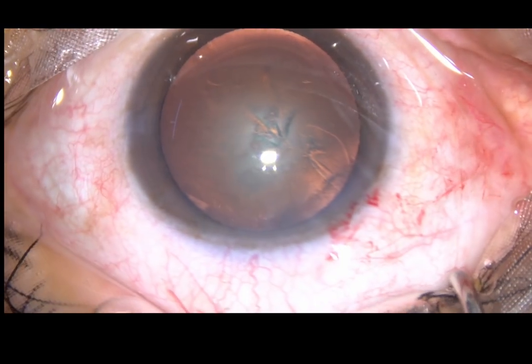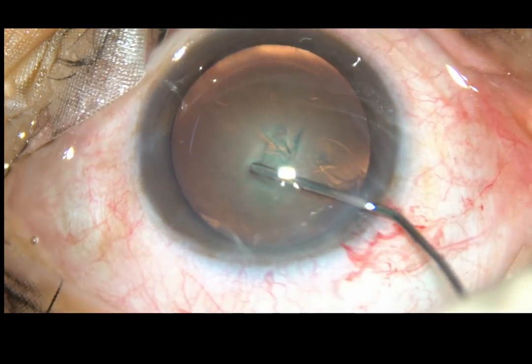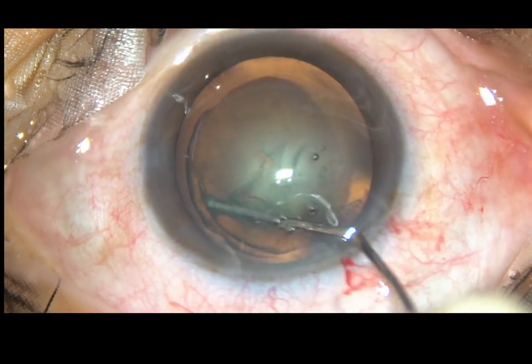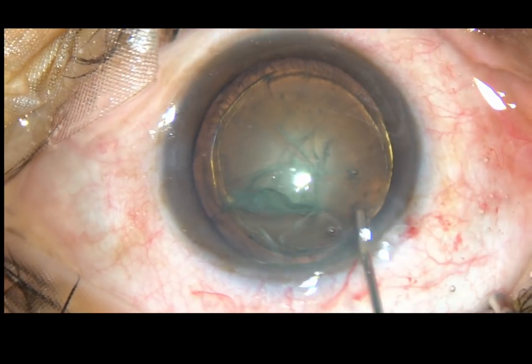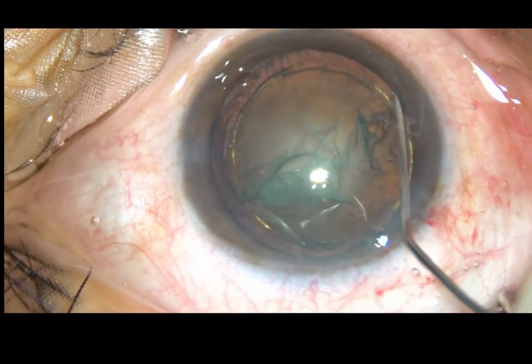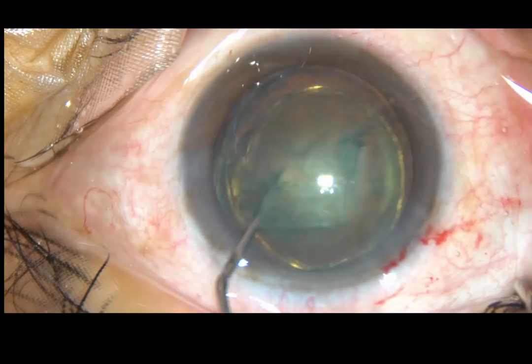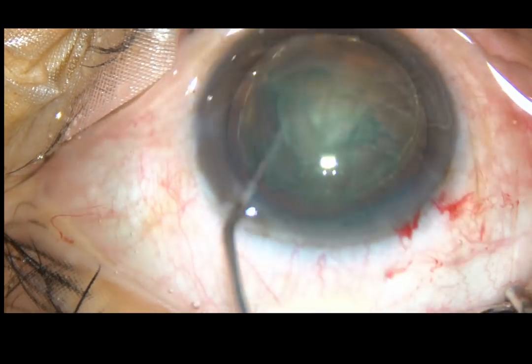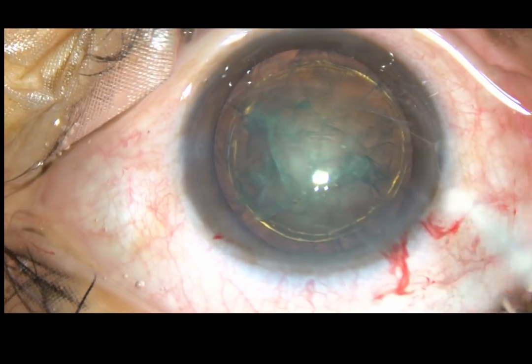Now, in this case, I have done hydrodelineation first. Hydrodelineation has produced two golden rings in this case. After hydrodelineation, the nucleus is rotated in the cartwheel technique.